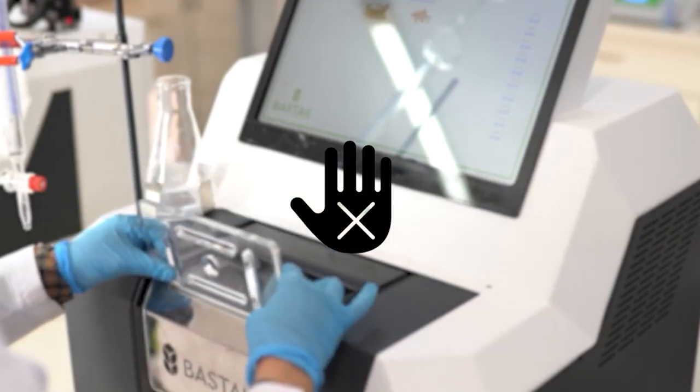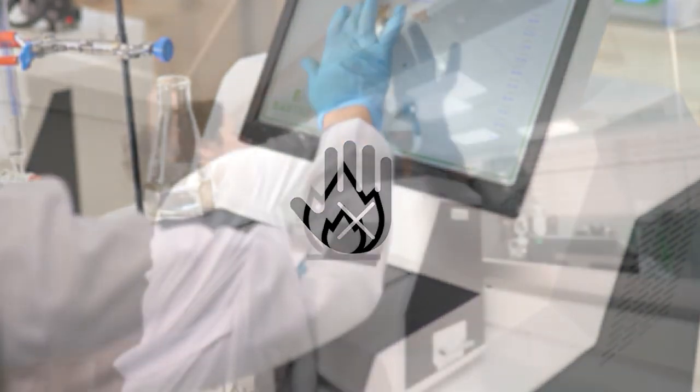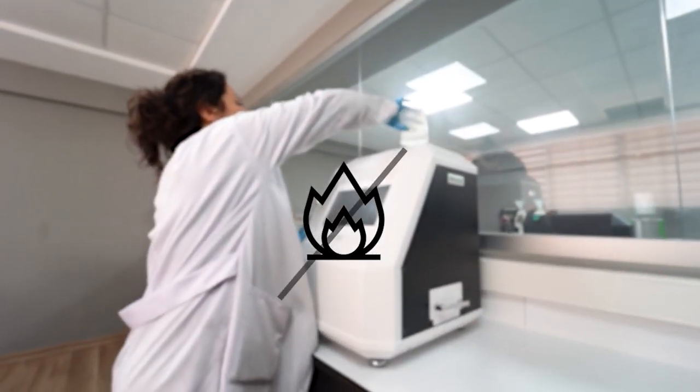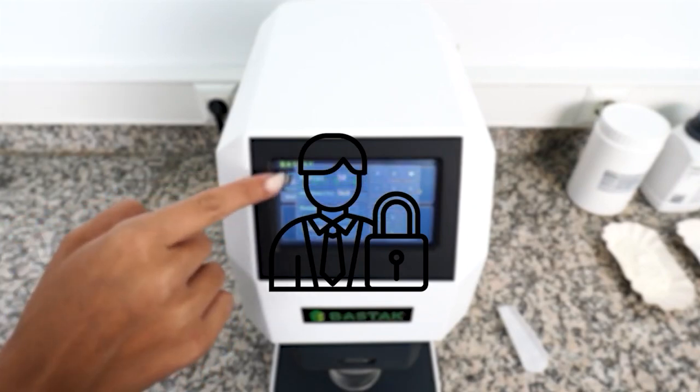The device should only be operated by individuals who are familiar with its operation. Flammable and combustible materials should not be kept on or near the device. Unauthorized individuals and companies should not be allowed to intervene with the device. In case of any problems, contact Bastak Technical Service.